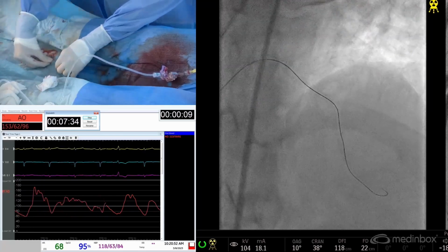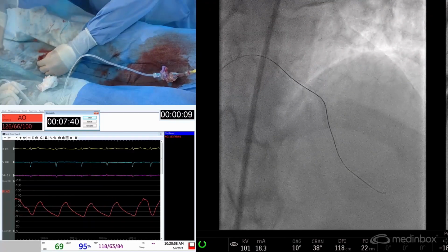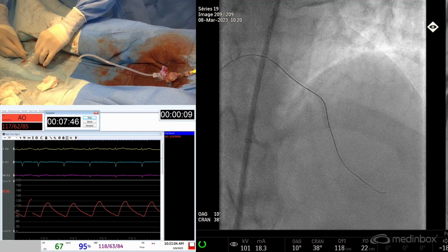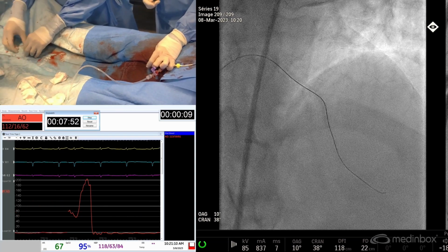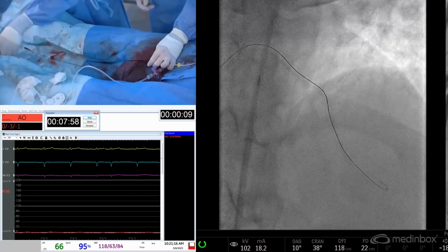The goal would be to go in with the Corsair Pro XS afterwards. We'll use the indiflator. Open the Y for me. Okay. Now I'll switch. Since it was tough to wire, I'll take the.